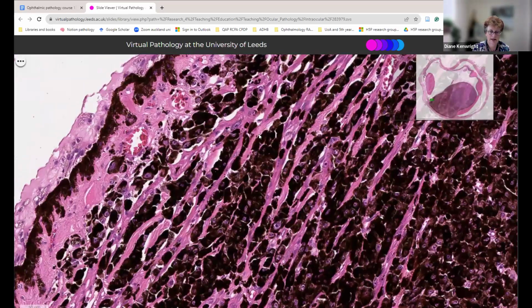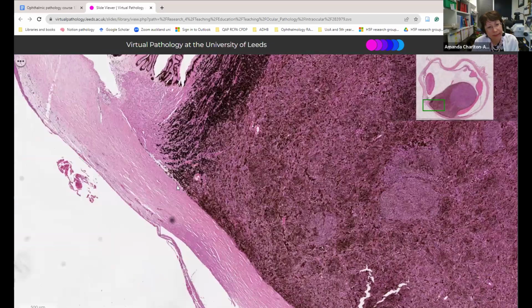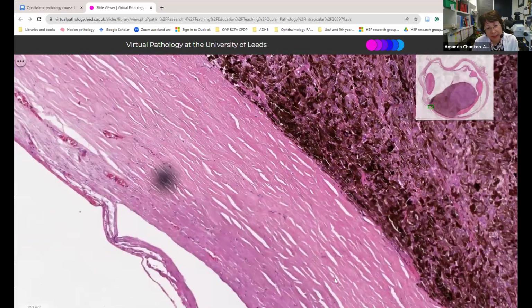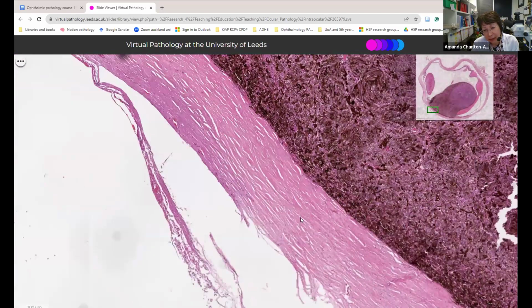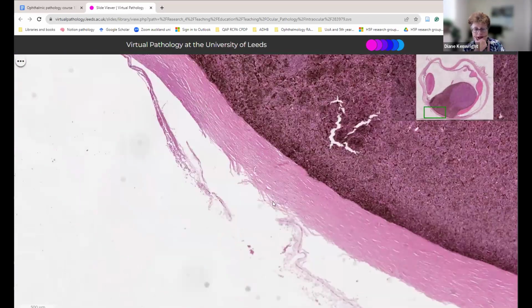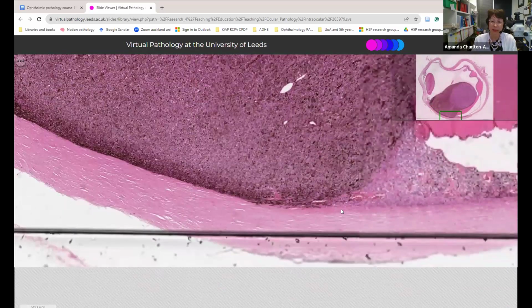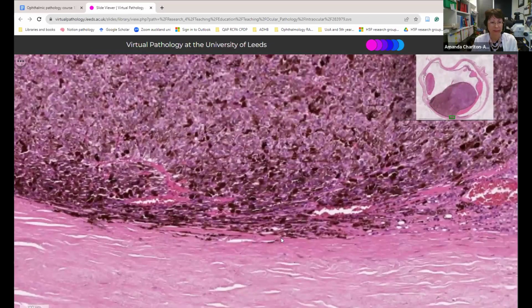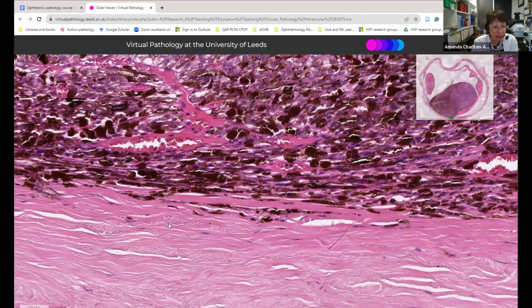And then, Amanda, can you please scoot along the sclera to see if there's anything there? We might see some pigment, but you mentioned something about pigment in the emissary veins not necessarily counting. That's right, you actually got to see the cells. So I don't think we have any scleral invasion there. Maybe not so far. I'm just rendering, it's just coming up. Okay. But pigment's not the same as a melanoma cell, is it? No, it's not. There's pigment by itself there, a little bit of pigment out there. Do you think that'll count as melanoma? I don't think so. No.